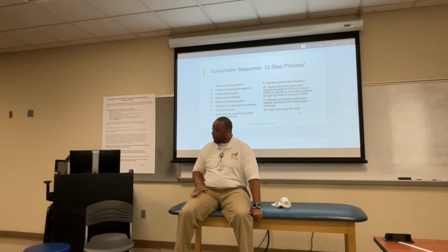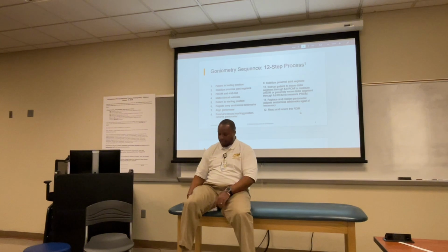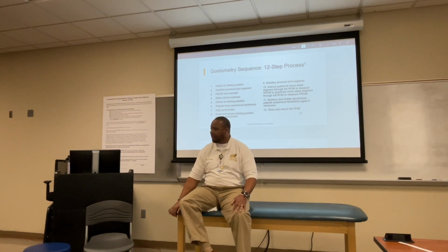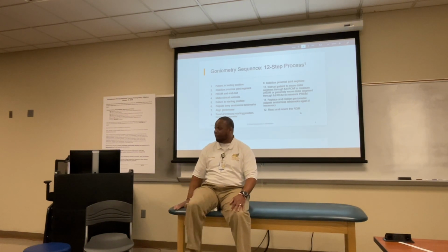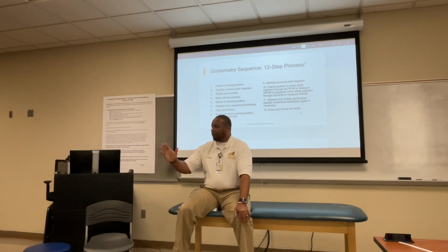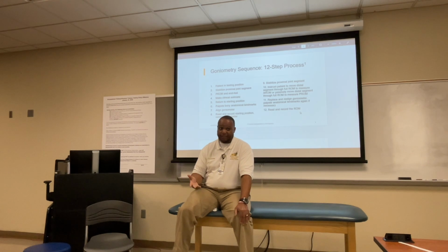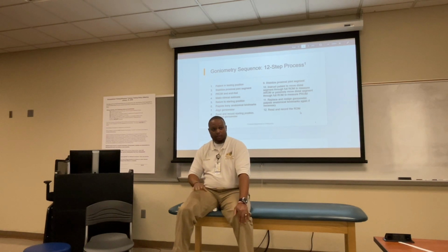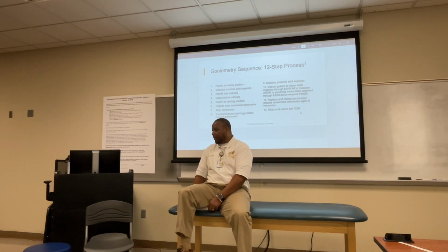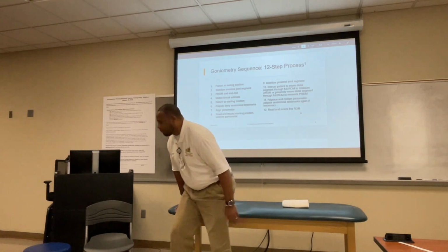So I tell the patient, keep your thigh down, don't lift it, and just move your leg so that it looks like this. Look how much less I get. But if I do this, I get much more, right? So, like Seth said, we have to know when to stabilize and where to stabilize. If you have a tech, you can get your tech to stabilize certain areas so that the patient doesn't compensate, and you get a more accurate reading of the patient's range of motion at that specific time.